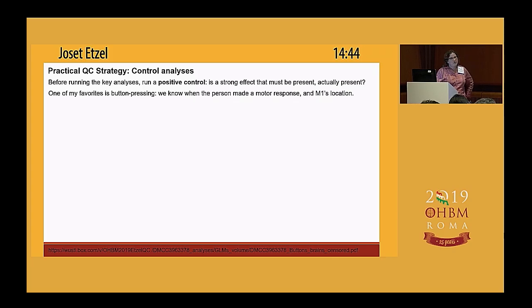So one of my favorites for this is button pressing, because since we do task fMRI, people are usually pushing response buttons. So I know when every single participant actually pushed a button, and I know where in left motor the finger is.